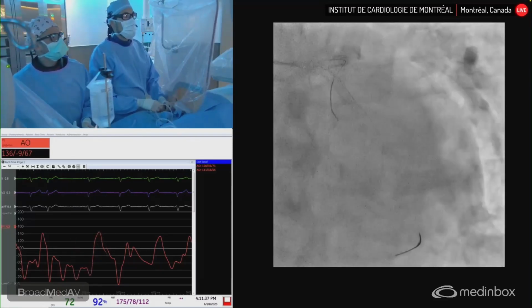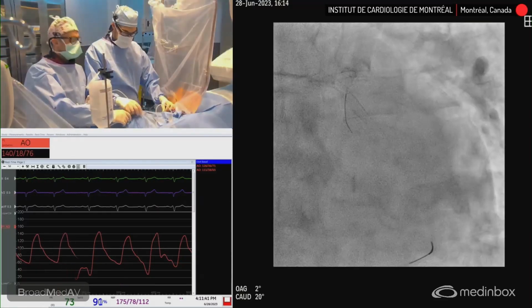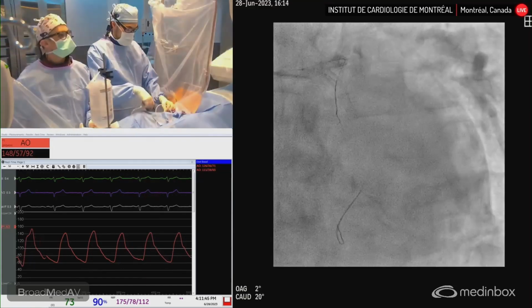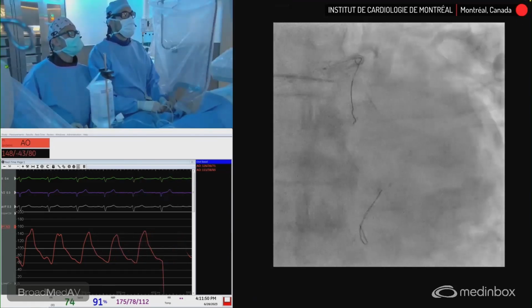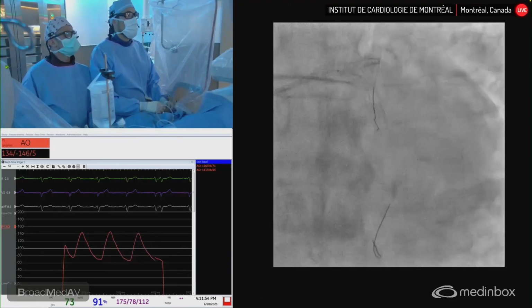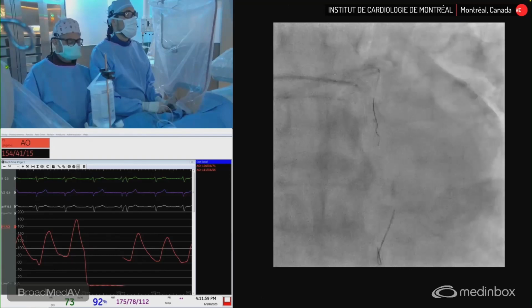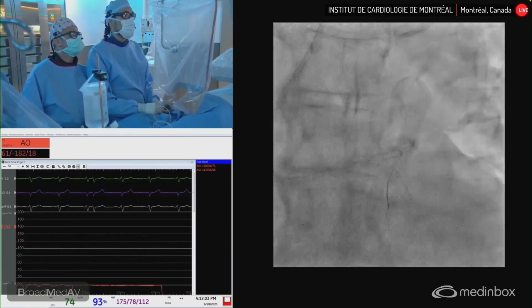Okay. I always like to see the distal end of your wire. Pull back your wire. Okay. Yeah, good. Because if it's too distal, it's gonna perforate. No, I don't like that either. Okay, you're too far now. Come back, pull back a bit. Stent boost. We'll be in the middle. No, go ahead, more pullback.